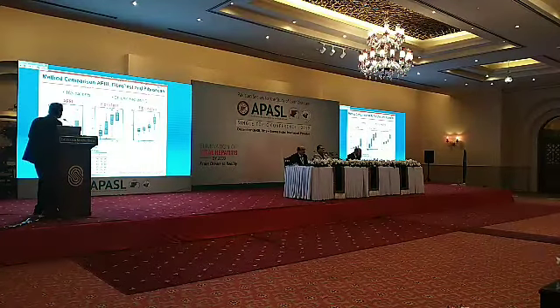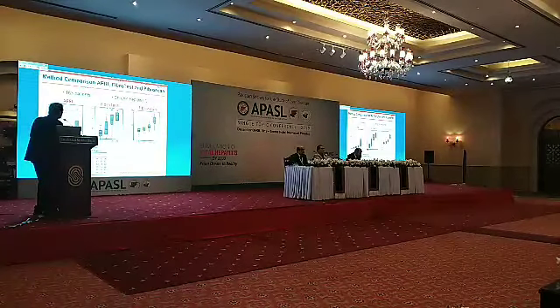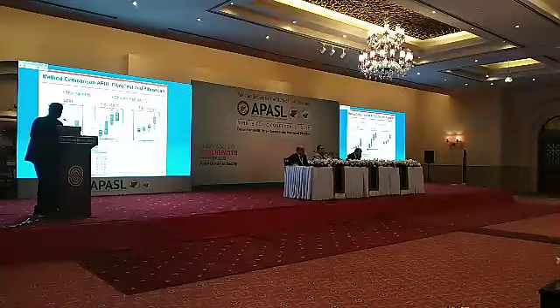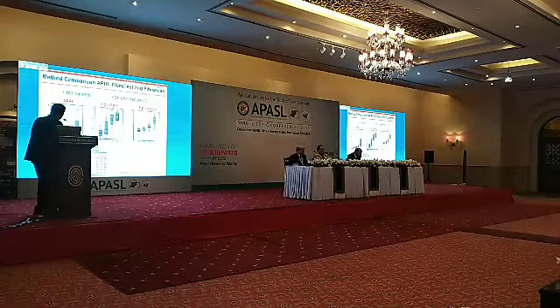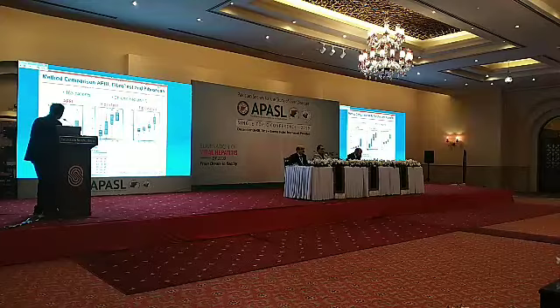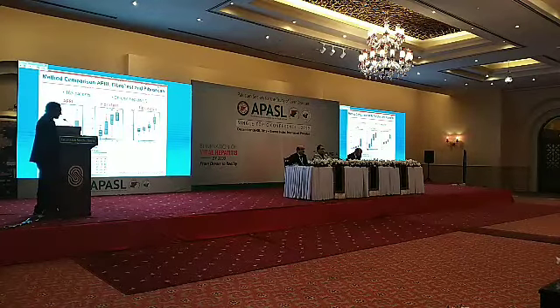If you compare APRI, FibroTest and FibroScan, the best to choose would be FibroScan, and after that FibroTest, and below that is APRI. But if you combine, for example, FibroTest with FibroScan, you get better results in sensitivities and specificities.